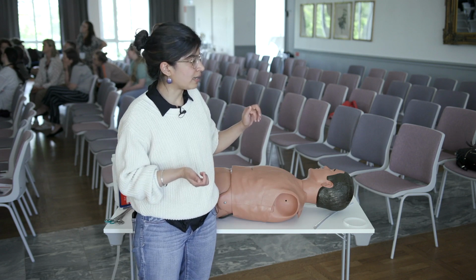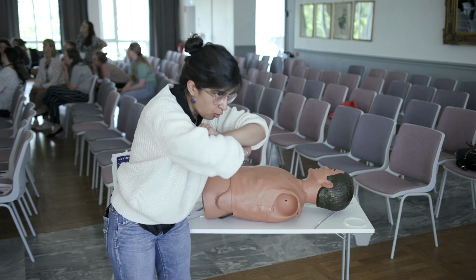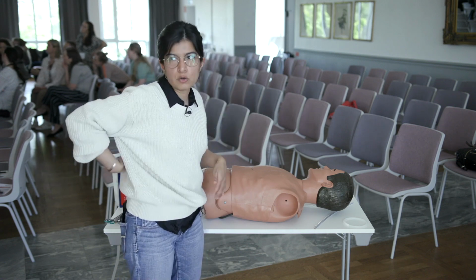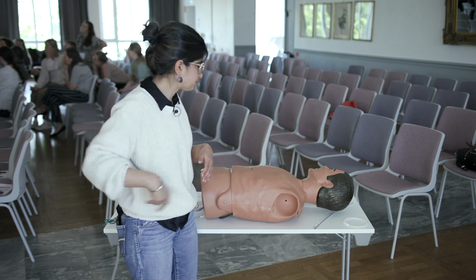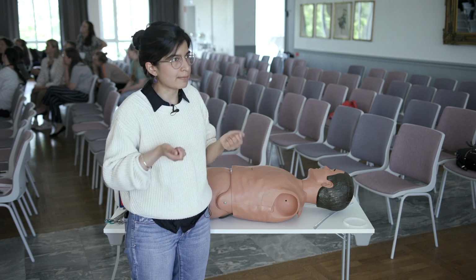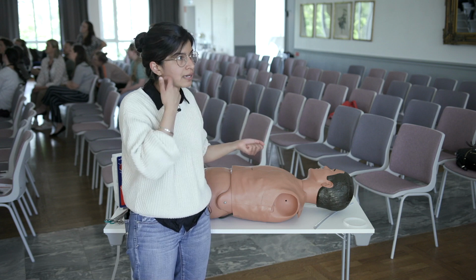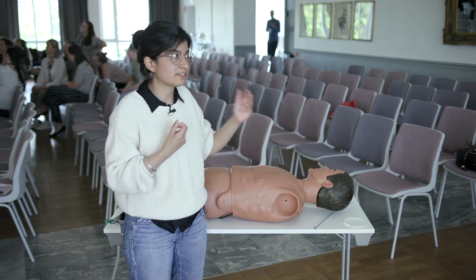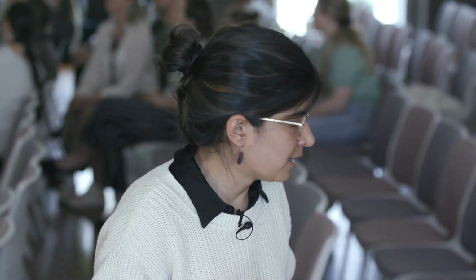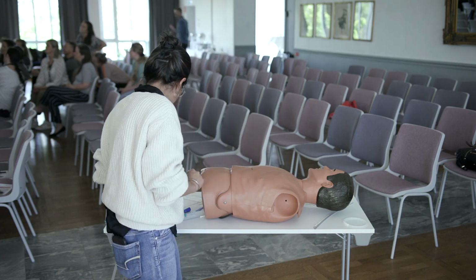If your patient's awake, if they're talking to you, you can have them sitting upright and leaning over a table, and the leaning kind of opens up the ribs in the back. I don't do this dynamically under ultrasound, but I always take an ultrasound probe and make sure that I'm above the diaphragm. I've seen drains that ended up in the liver or in the spleen, and you never want to do that, especially on an ECMO patient, which is what happened. But anyway, that's neither here nor there.